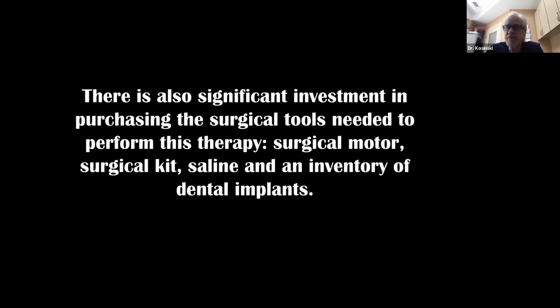There's a significant investment in the purchasing of surgical tools needed to perform the surgery, a motor, surgical kit, sterile saline, inventory of dental implants.